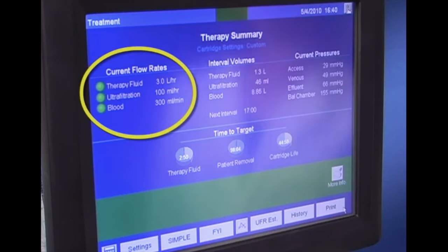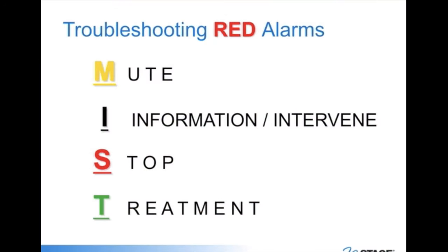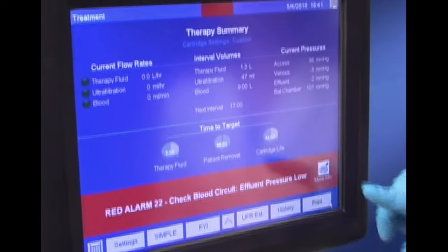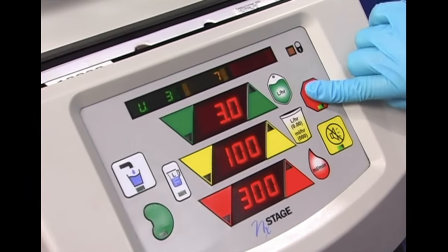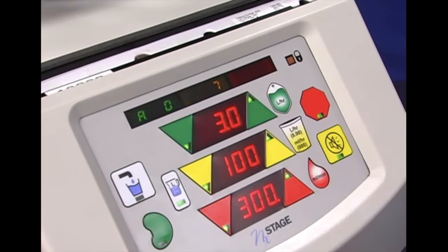Check to see if your pumps have turned on. Red alarms are indicated by a specific audible alarm sound and a red condition bar on OneView. Use the acronym MIST to resolve a red alarm: Mute, Information, Stop, Treatment. First, mute the alarm by pushing the mute button — this is the M in MIST. Click on the More Info button to get more information to resolve the alarm — this is the I in MIST. The pop-up screen contains the possible causes and corrective measures. Once the problem is corrected, push the Stop key — this is the S in MIST. Next, press the Treatment key — this is the T in MIST — to continue the therapy. Check to see if your pumps have turned on.